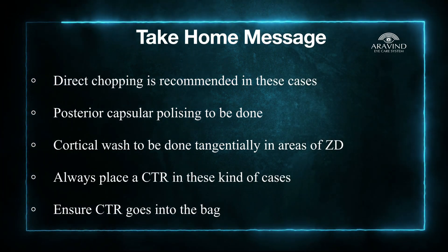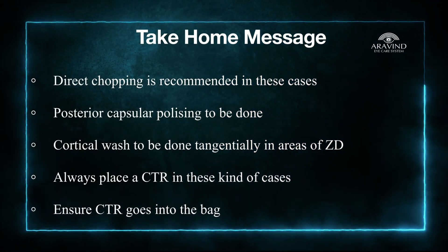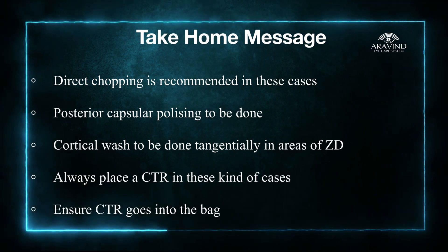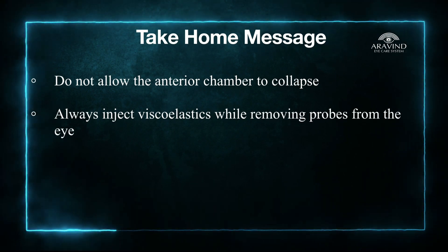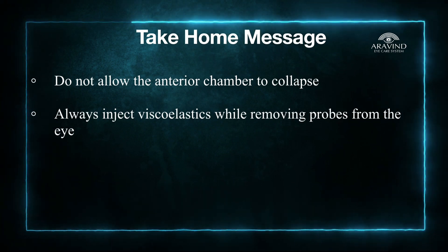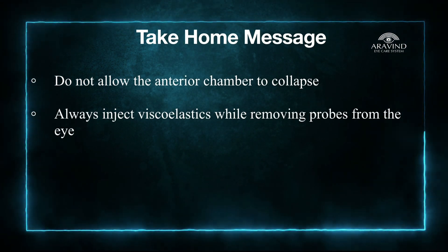Always place a CTR in such cases. Keep your microscope and eyes focused on the rhexis margin so as to ensure the CTR eyelet goes into the bag first. Do not collapse the anterior chamber at any point of surgery, especially while removing the probes, which can lead to vitreous disturbance. Always inject viscoelastic while removing the probes.